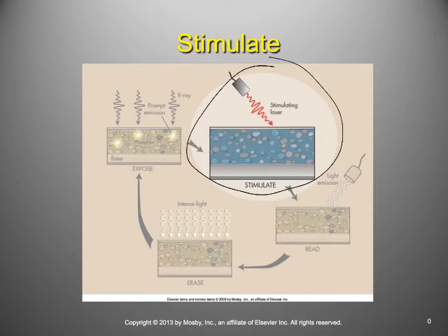So we want a very, very small diameter laser that's going to scan over this. That's why it takes some time to develop a CR image. It's limited by the size of that laser as it's scanning over the huge surface of the image receptor plate.